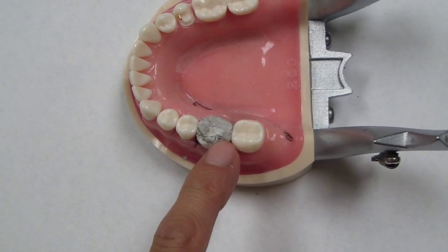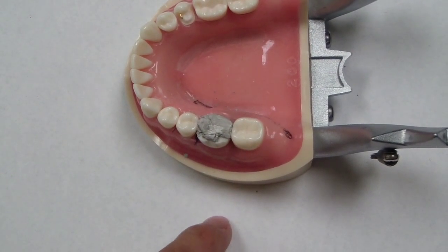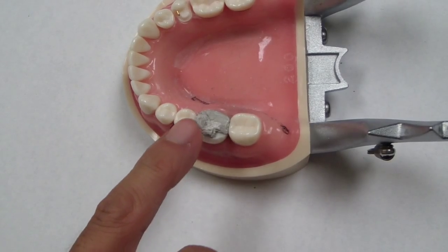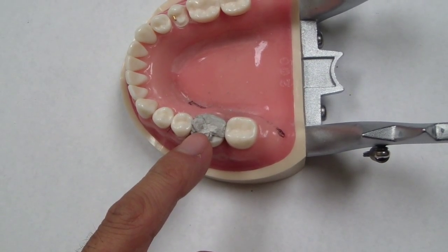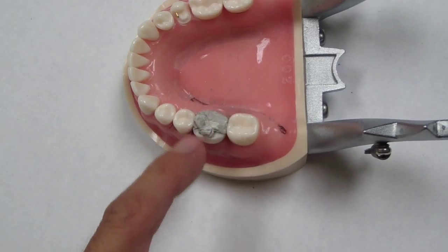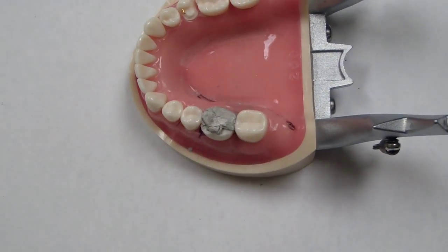Here's a simple technique whether it's a vital tooth or an endodontically treated tooth where you're using the pulp chamber for retention in the core. What we're going to do is fabricate a provisional restoration, hollow it out, and then prepare our tooth as it is with the old restoration and replace the foundation restoration. You'll see how it plays out.